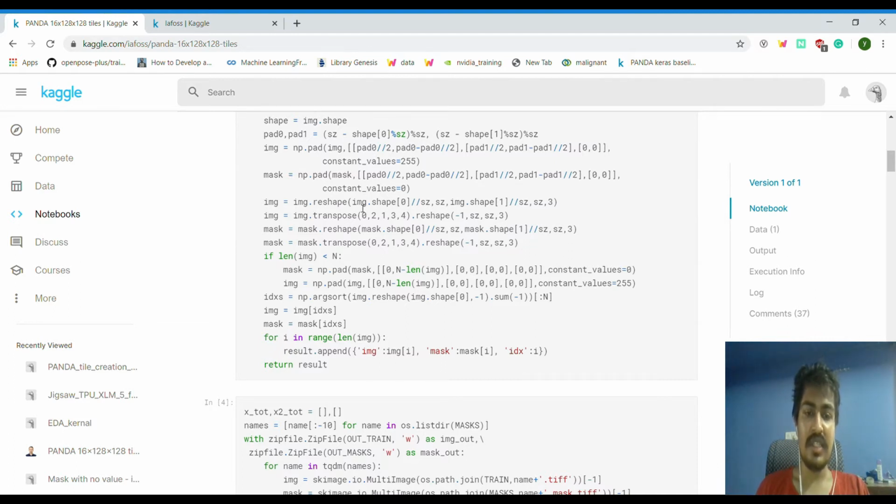Okay, and then comes the interesting part. How are you going to make them into grids, and what is the fastest way to make them into grids? You can't just manually write an indefinite loop going from 0 to 128, then 128 to 128 plus 128. That would be tedious work, right?